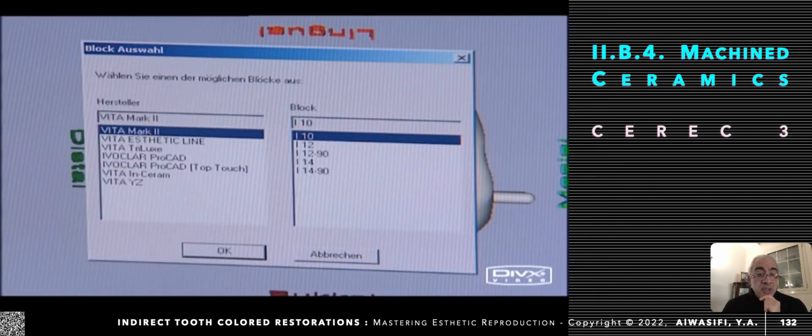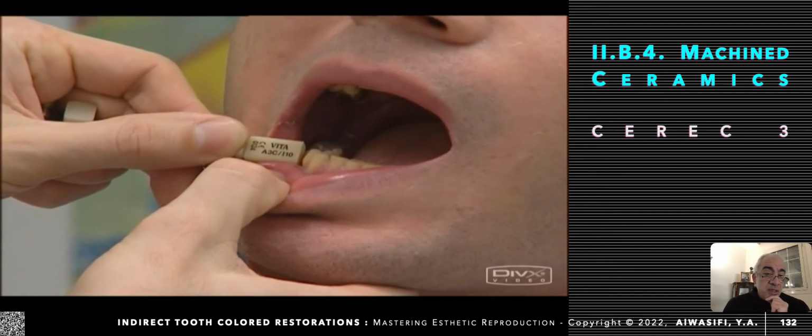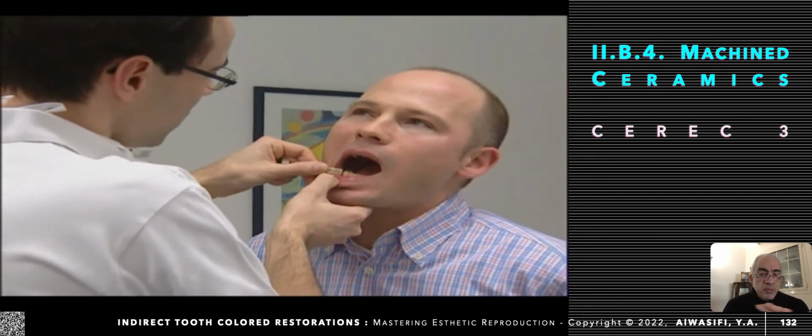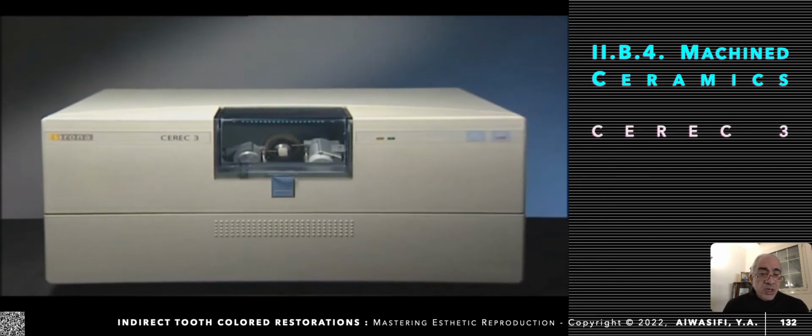Okay, this is now, he's now checking the shade matching. I object. By all means, he is violating the infection control. Okay, at least he should wear gloves.